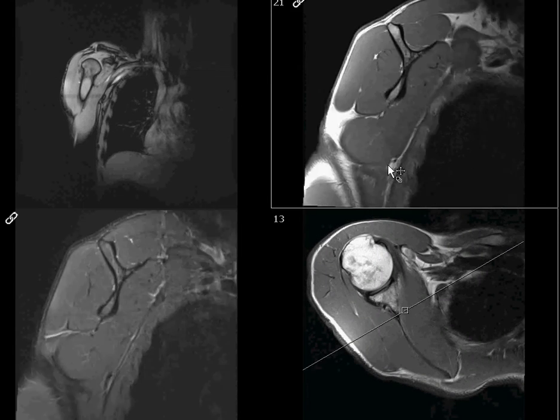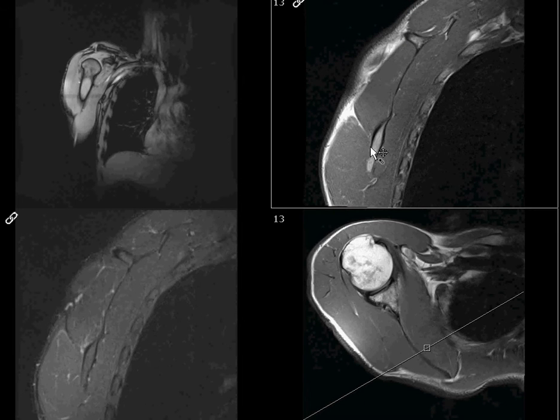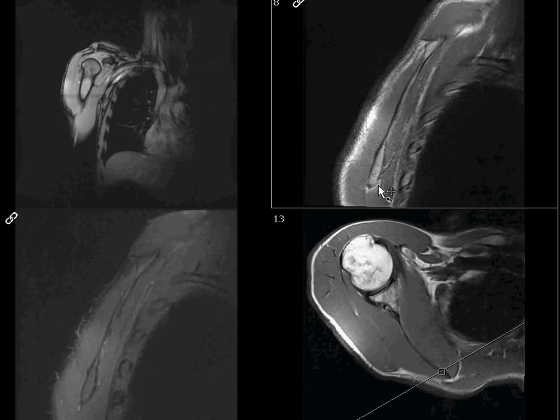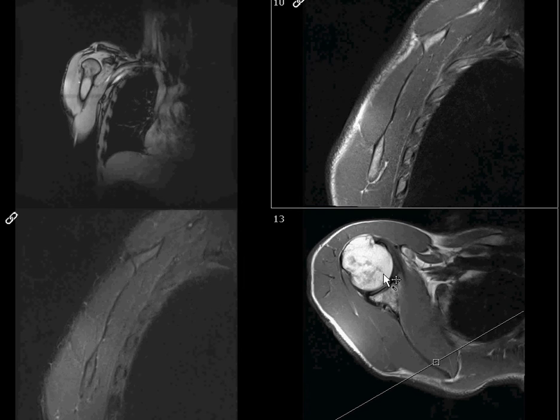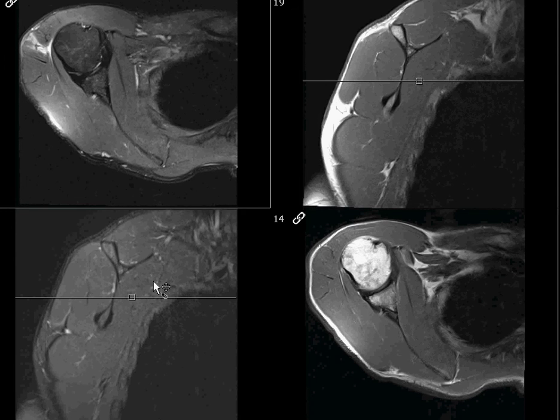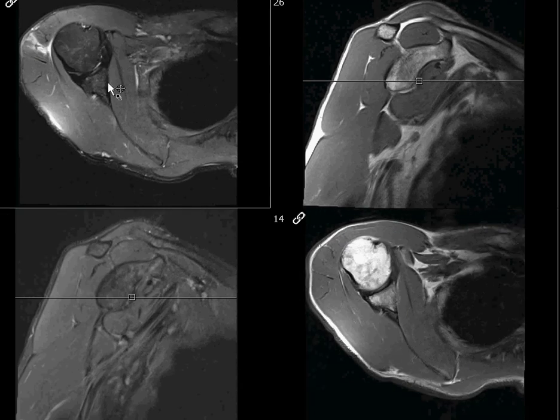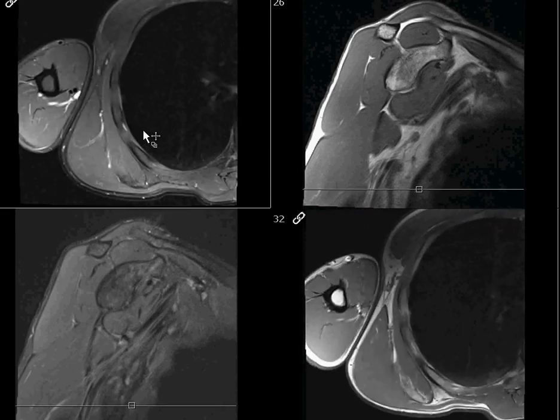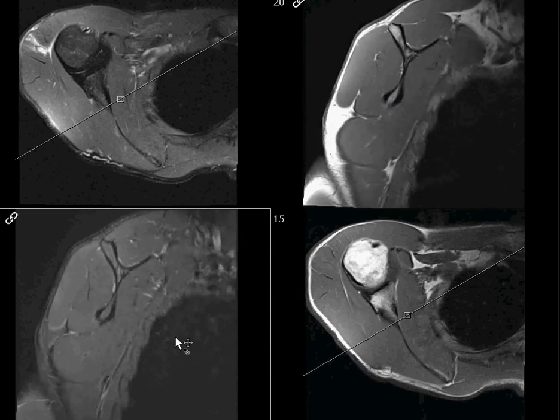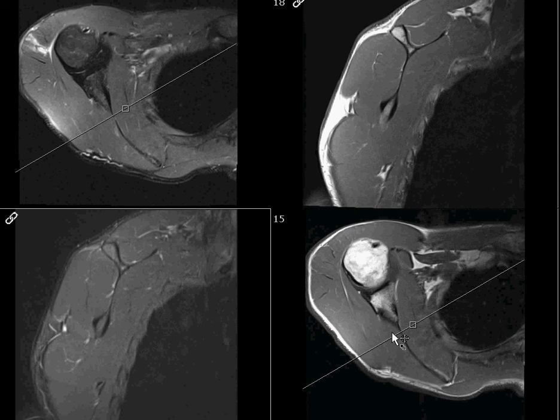Going all the way through, you can see the scapula — it's very thin here, here's the inferior tip, and we can see between the chest wall. We have a couple of T1 sequences and then a couple of STIR sequences, again sagittal oblique and axial. Generally speaking, a coronal isn't all that helpful, so usually we just have those four sequences. When you see scapula, that's not a routine shoulder — it's a larger field of view dedicated to the structure and the surrounding chest wall.